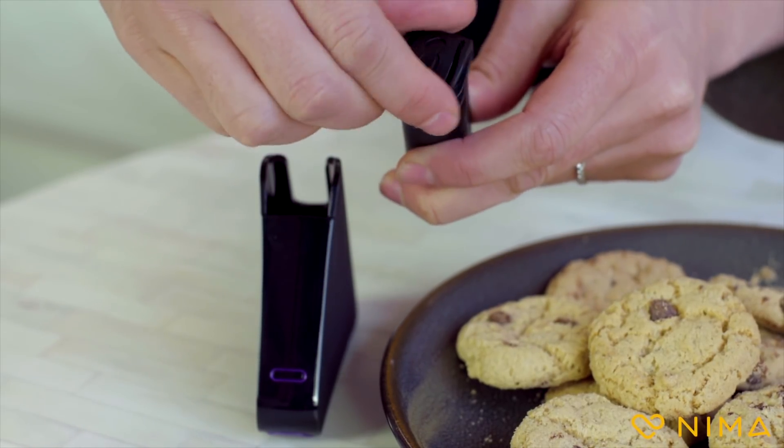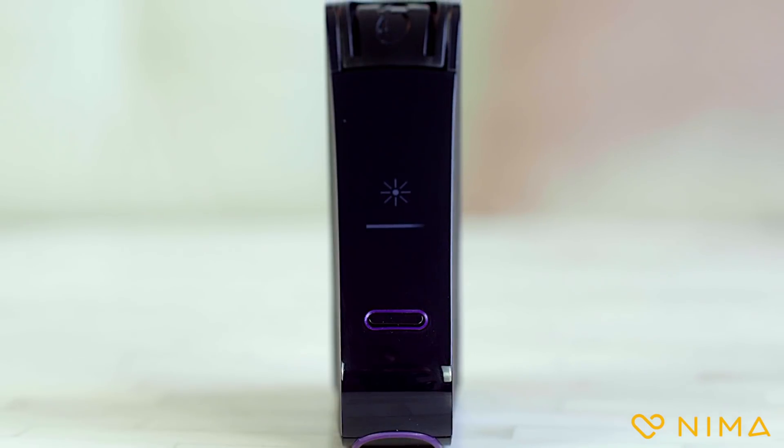The next step grinds the food. Keep twisting until it's closed. Now insert the capsule into Nima. Press start. Nima does the rest.